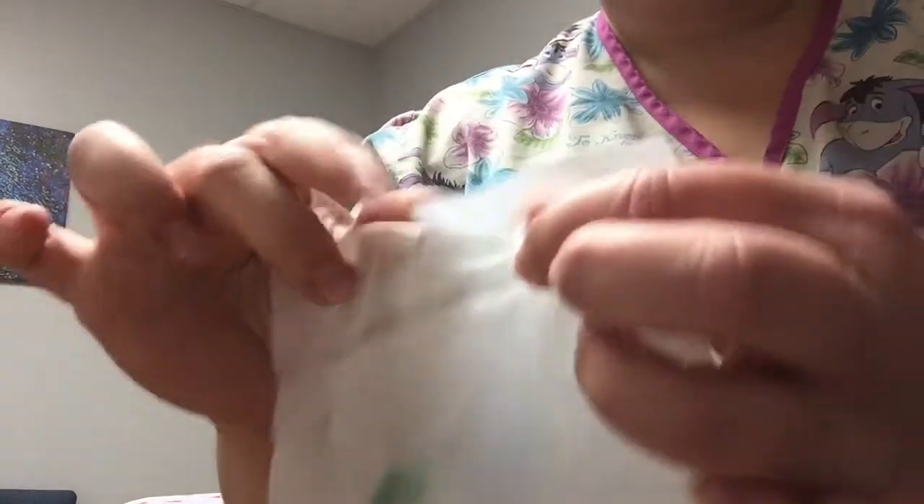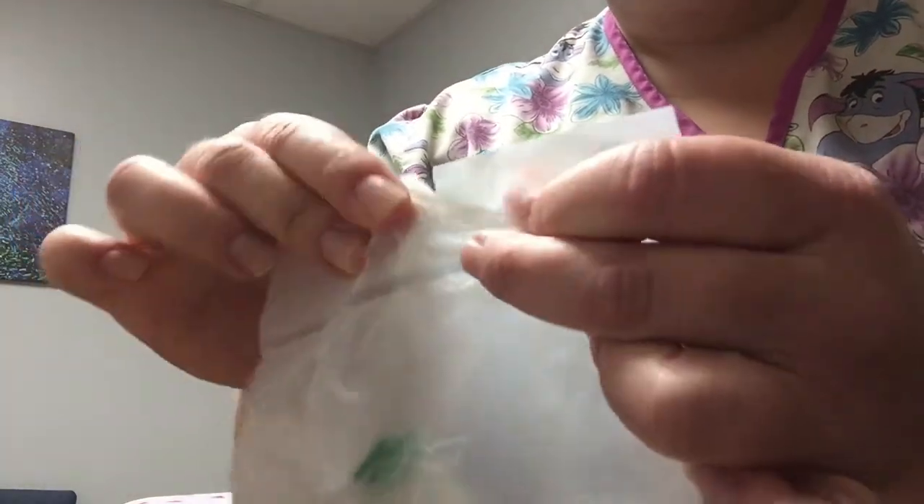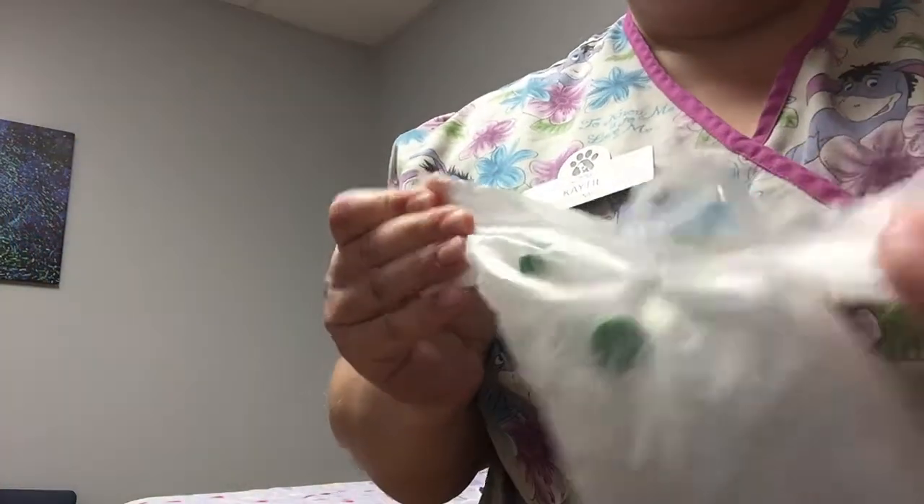This brand of bag has a little peel right there. If the bag has a little moisture in it, that's okay. They steam seal these, so most of the time that's not because the bag is leaking — it's because they steam seal them for sterility.